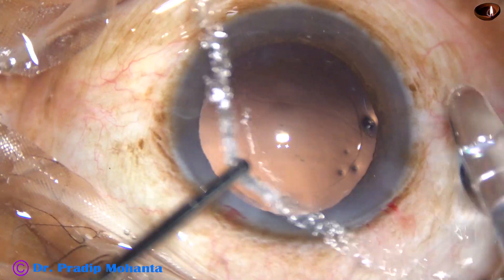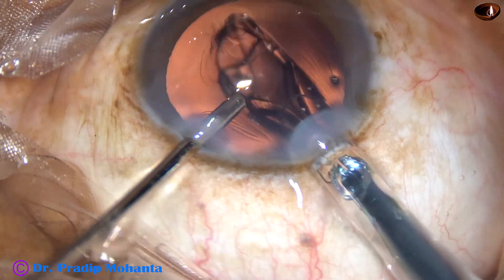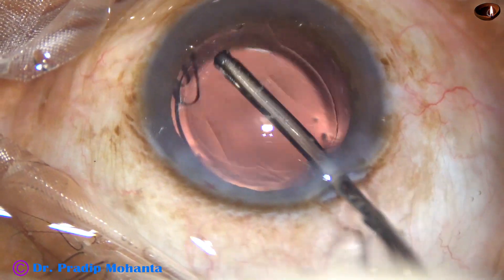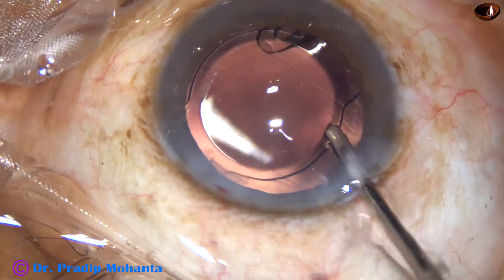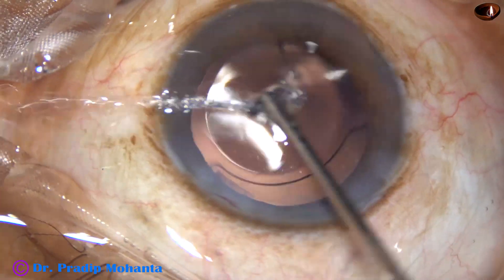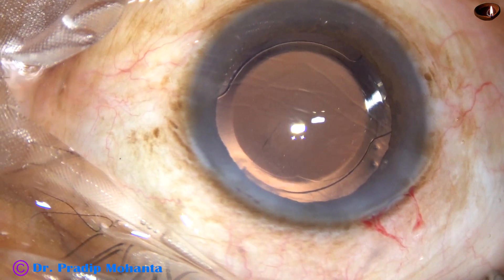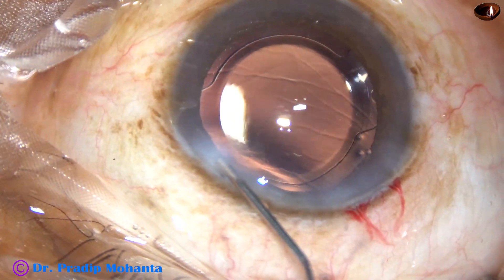Now this is hydro-implantation of an intraocular lens. In this case, the leading haptic is attached to the optic and will get released only after some time — we have to wait for that. Sometimes we may have to release it using two instruments, but usually these hydrophilic lenses detach after a few seconds.